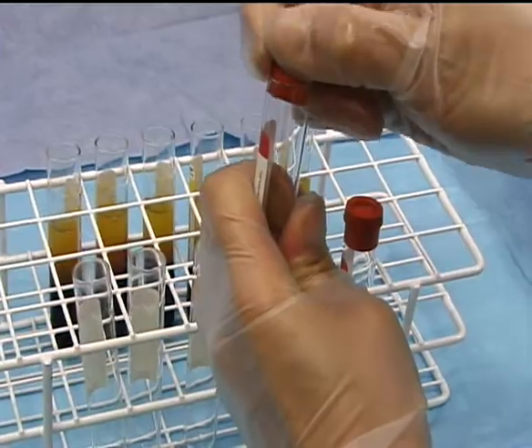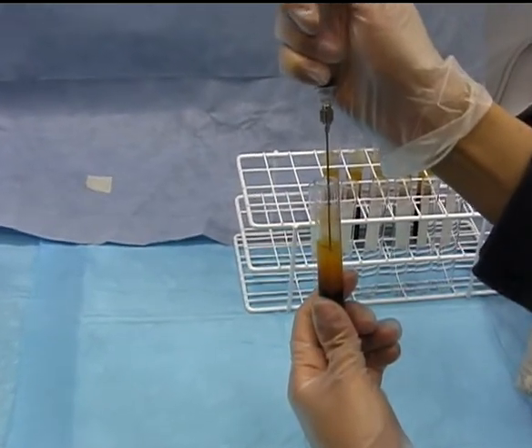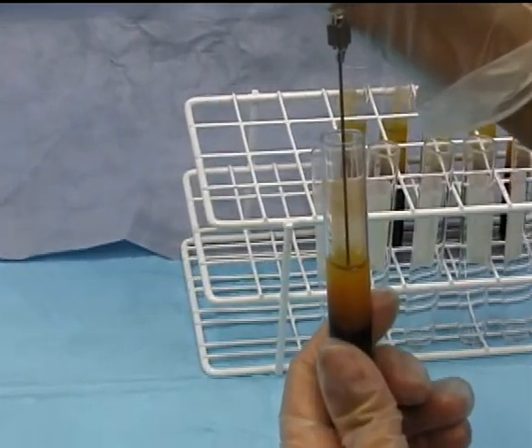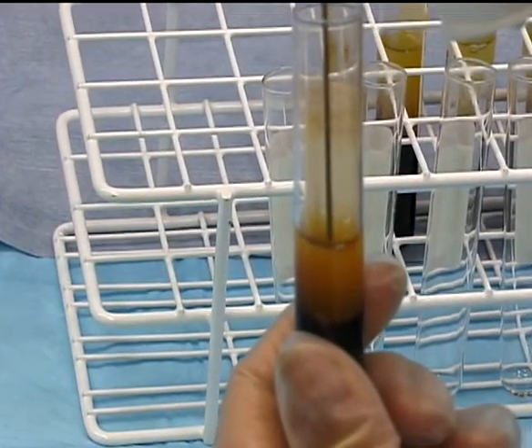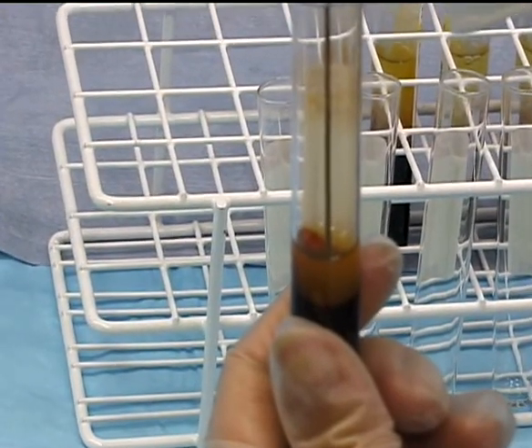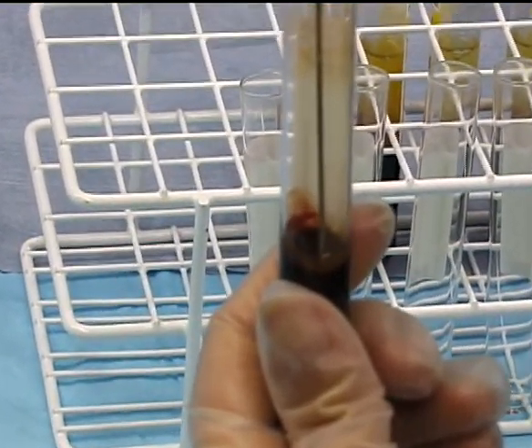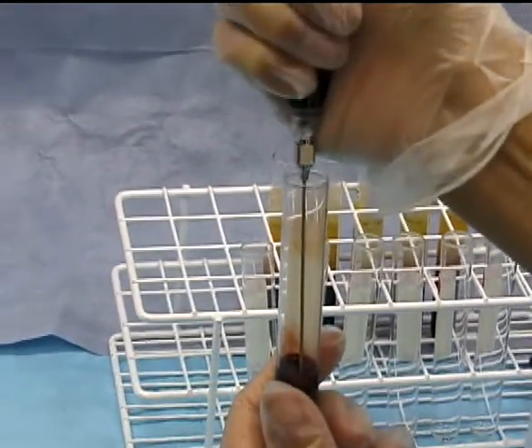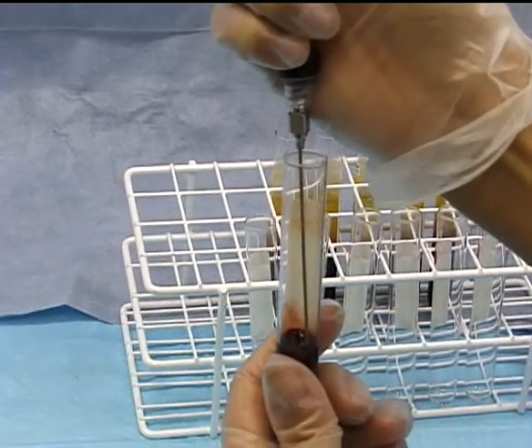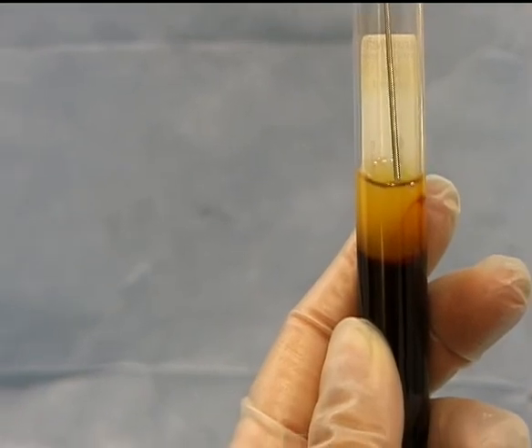Their tops are also removed and placed in the front of the rack. Using the 2.5-inch needle and syringe previously attached, the straw-colored liquid is gently removed from the tube, moving the needle downward as you draw. Stop when you reach the red blood layer. Taking one or two millimeters of this red blood cell layer is not a problem, since it often contains significant platelet concentrations, and ensures that you have removed the entire platelet-rich plasma layer at the interface. This procedure is then repeated for each of the tubes previously centrifuged.